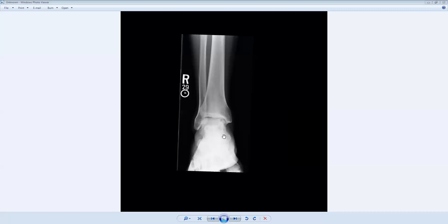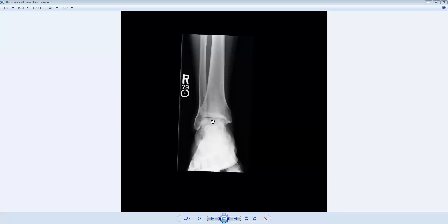Notice that we see no cortical break to suggest a fracture. In fact, the alignment of the ankle is congruent. We say that the ankle mortise is congruent, meaning the articulations between the distal tibia, the fibula, and the talar dome are aligned in a satisfactory anatomic alignment.